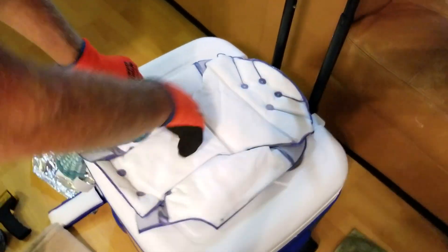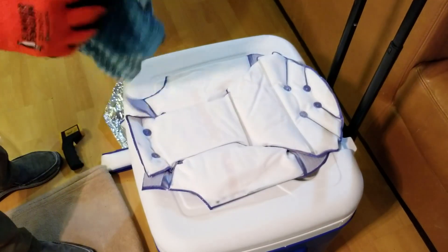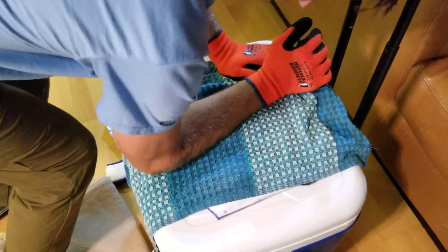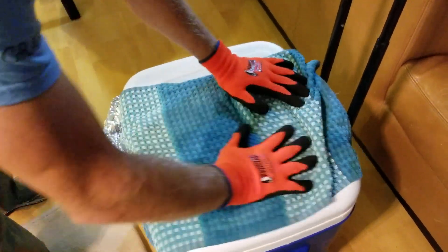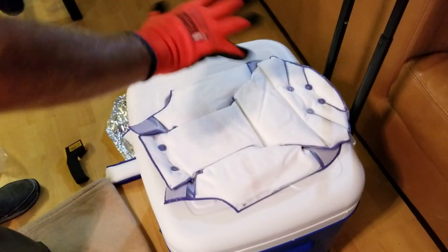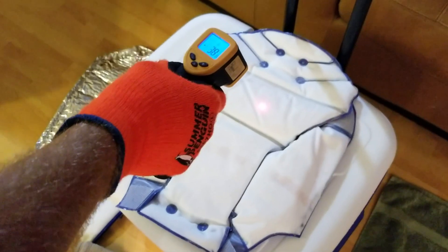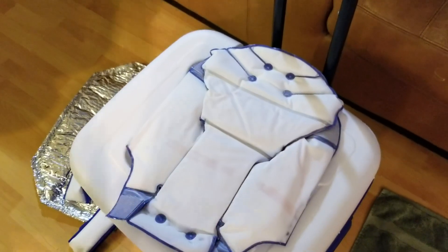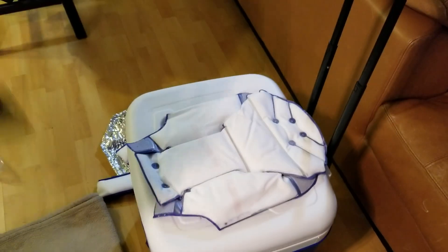These areas were a little warm and you can see they're a little harder. If you want to cool those down, put your towel over it and kind of knead it a little bit to get it down to the right temperature. What we've learned is, if you do it just right when you repack the cooler, it's almost ready to go without any of that. Checking it now — negative 34, so we're good. That one's negative 25, so this one is going on the head.